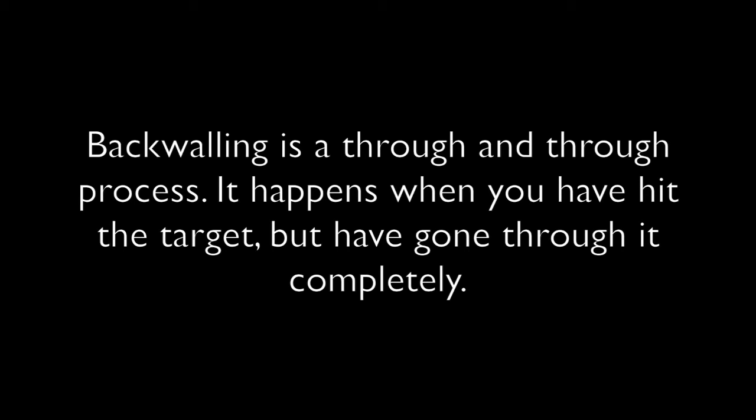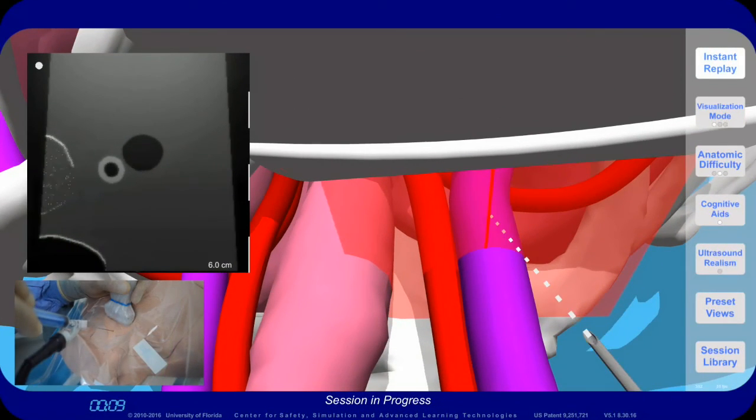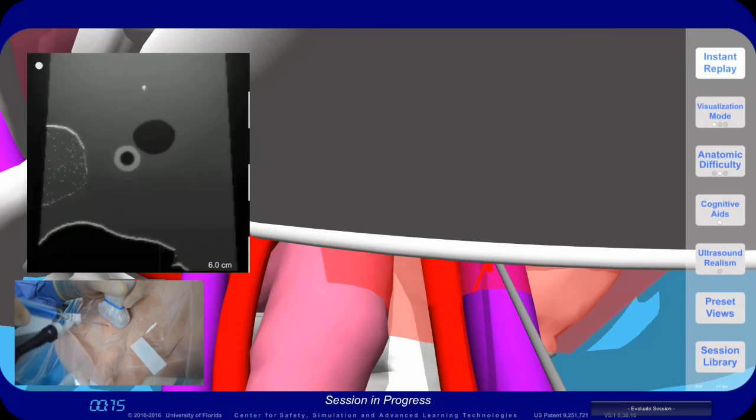Backwalling is a through and through process. It happens when you have hit the target but have gone through it completely. Backwalling is easy to do when you enter the needle too close to the probe and when the needle tip is inserted far beyond the ultrasound beam.